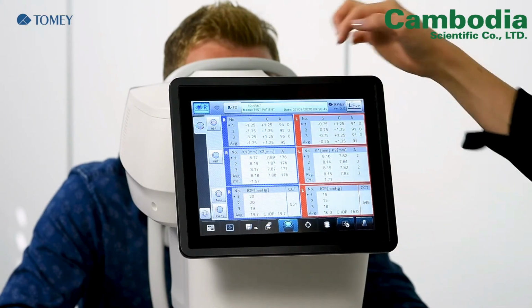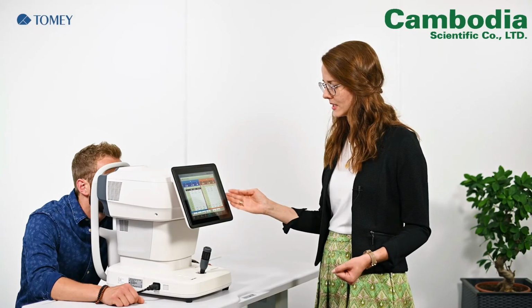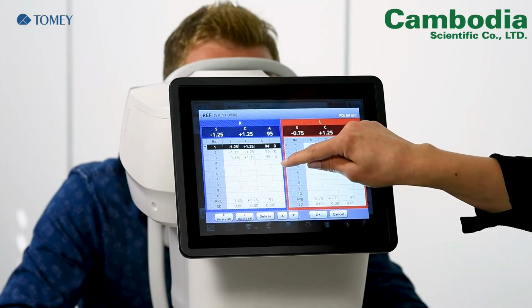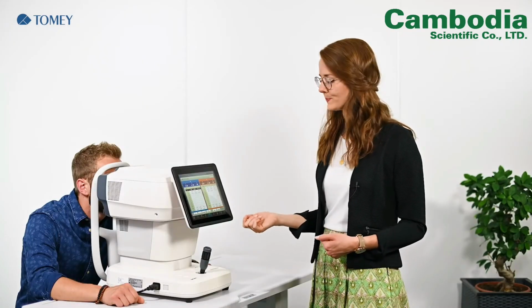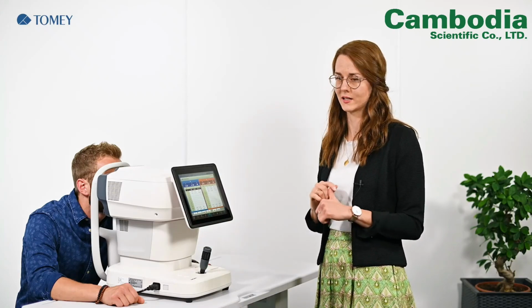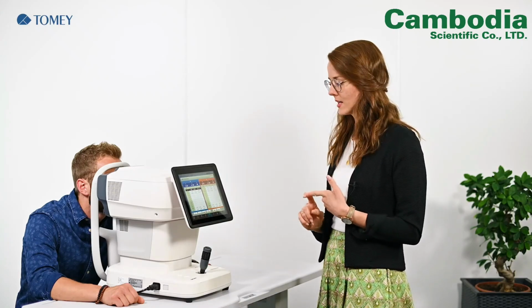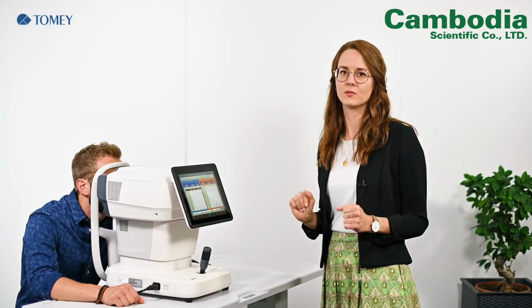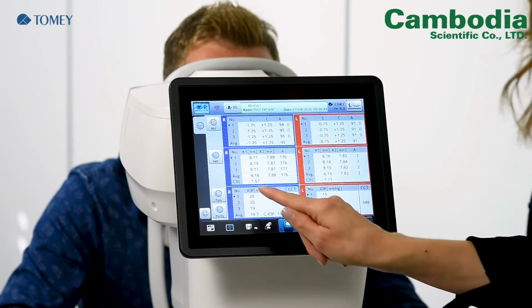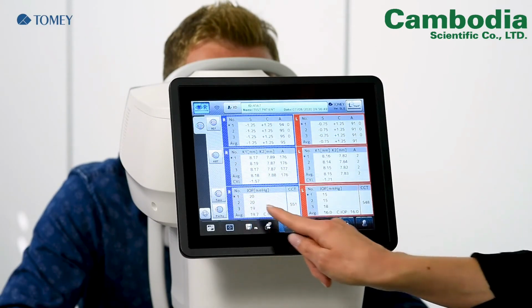You can easily type into the number of measurements, and in the last row you see the reliability of the measurement. In this case it is 0, and 0 is the best reliability. Worst would be number 9, and of course an E would be an error message. Okay. Same is with the keratometry, and here you see the tonometry.